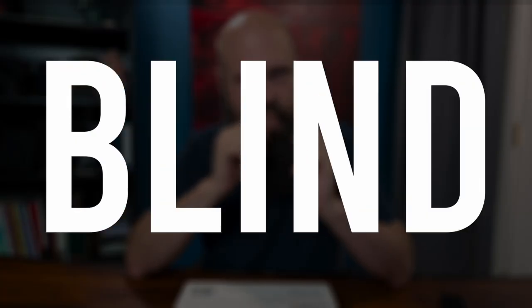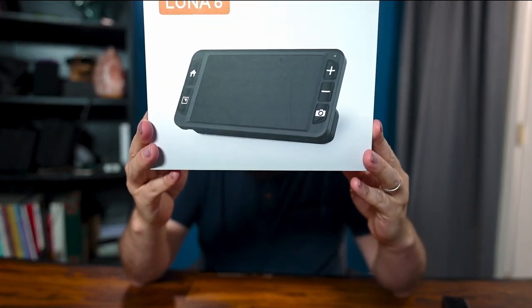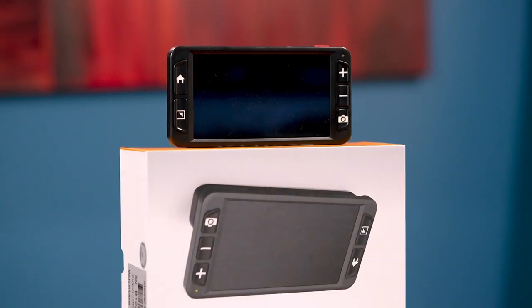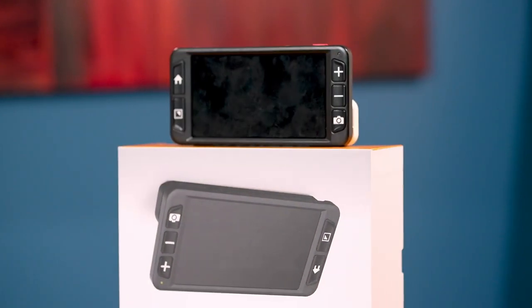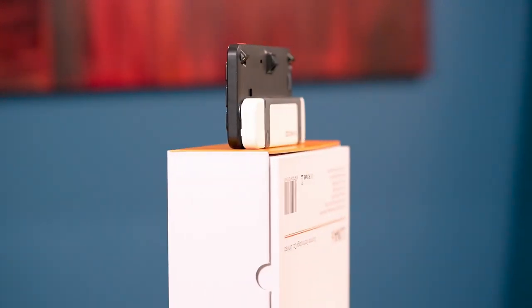Hey guys, it's Sam. Welcome back to The Blind Life, where I help you learn how to live your best blind life. Today we are taking a look at the Luna 6 digital video magnifier brought to us by ZoomMax. This is a pretty affordable 6-inch digital video magnifier that offers a lot of perks — one in particular I've never seen on any other digital video magnifier. Let's run the intro and then we'll talk about it.